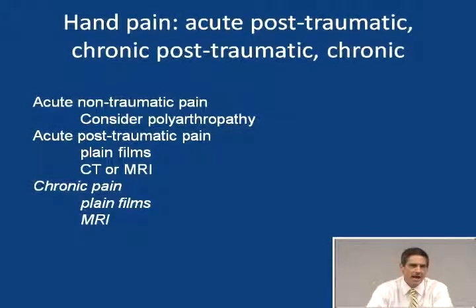Moving along, chronic hand pain. You're going to get back to arthropathy right away here. Is it monoarthropathy? Is it polyarthropathy? Is it really something we need imaging for? Because a lot of times, again, the imaging may not help you much. If only one joint's involved, you should think in terms of MCP joint strain or arthritis. Plain films can distinguish those two. And gout, you can usually find on a plain film, especially if it's been there a while. MR is rarely used unless there's a suspicion for tenosynovitis or a retained foreign body.